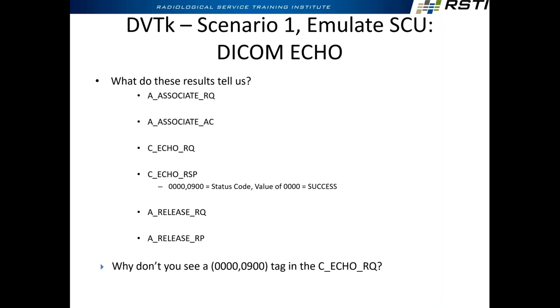The cool thing about Emulator is you can do that, and it will give you that, and you can show it to people. Oh, look, here's this PDU, here's that PDU, this happened, this isn't happening. It's on a piece of paper you can print and send somebody, and you can't refute it.